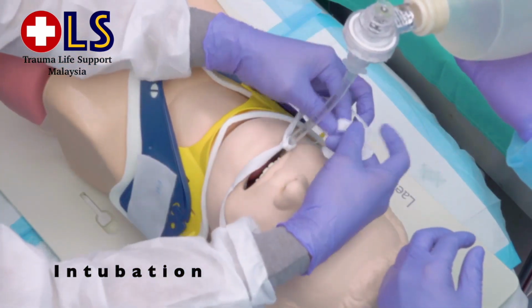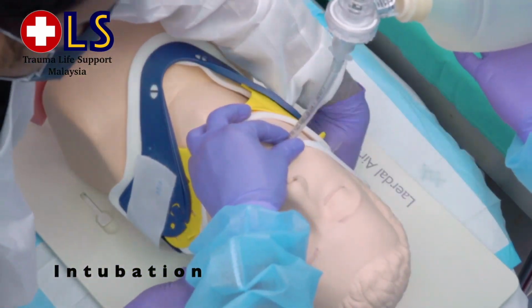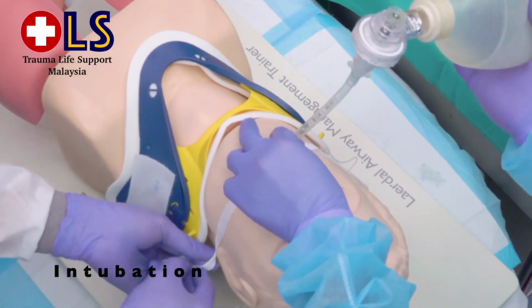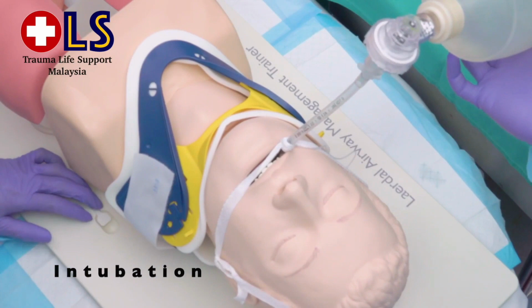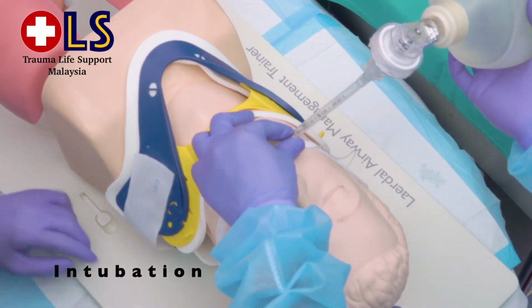Double knot is required. Okay. Connect to ventilator and proceed with post-intubation care.